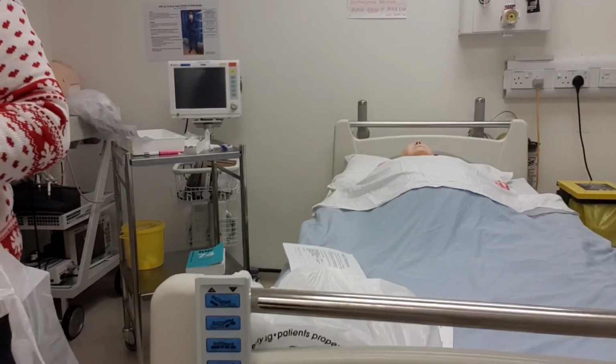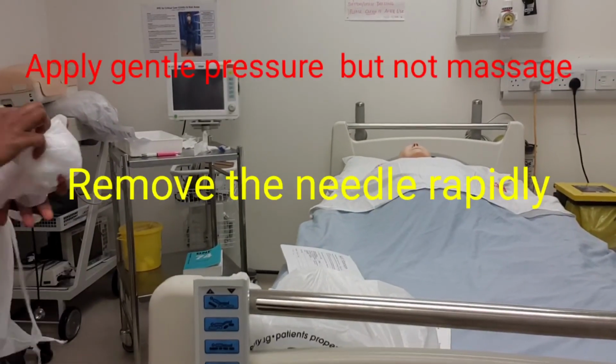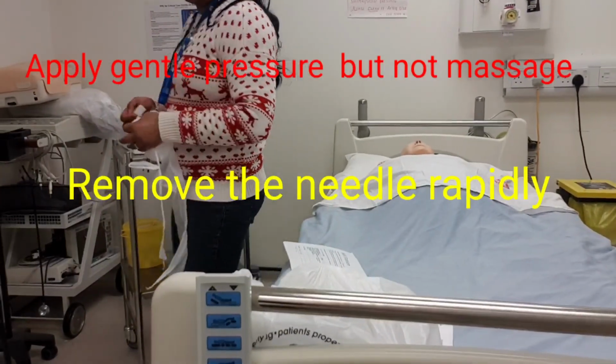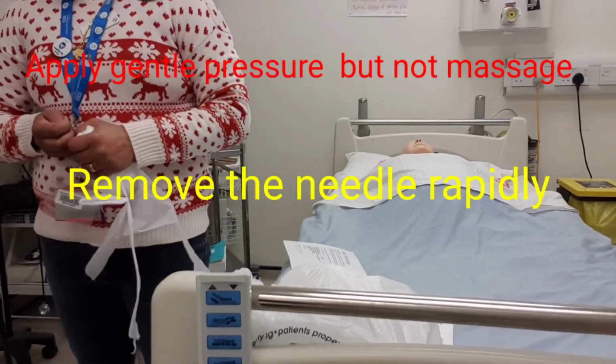You don't know what I'm doing. Never happen. Withdraw the needle rapidly.